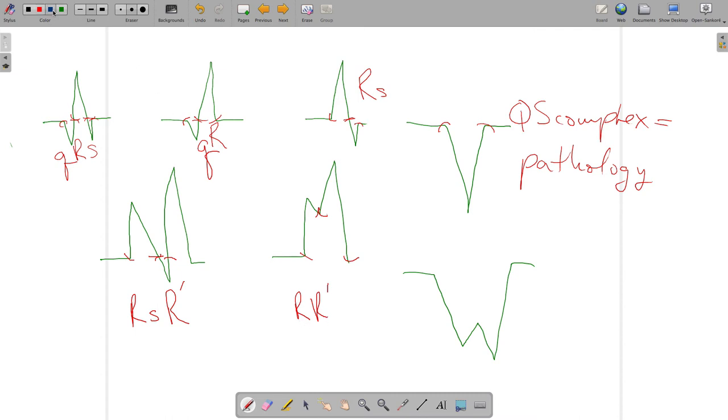Now, just as I showed you with the atria that we're depolarizing, there are actually two events taking place here. There's this first event, which is actually one of the ventricles. Because there's a delay in depolarizing one of the ventricles, there's going to be this additional event that takes place, and that's depolarization of this second ventricle. Since you can't see just one ventricle depolarizing in isolation of the other, instead of showing you one and then the other, it puts them both together, and that's why you get this weird pattern that takes place.